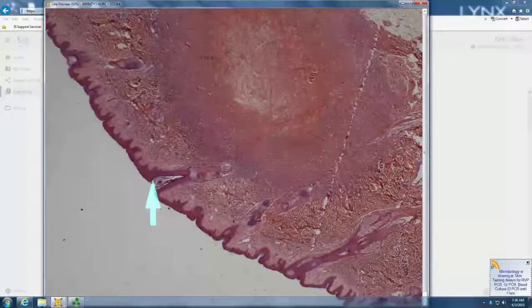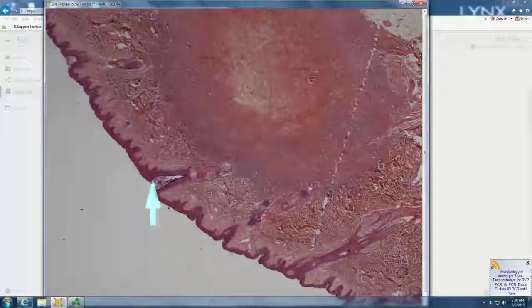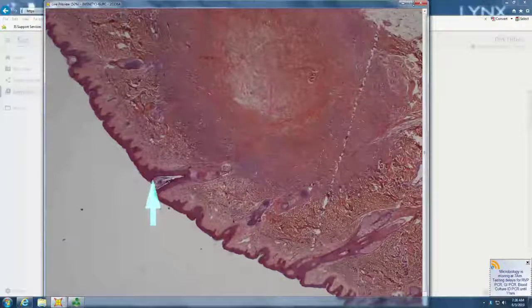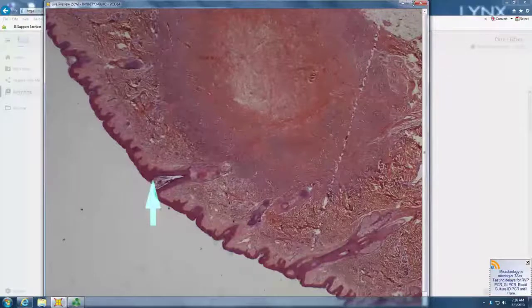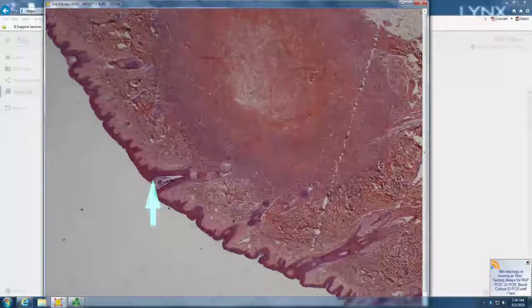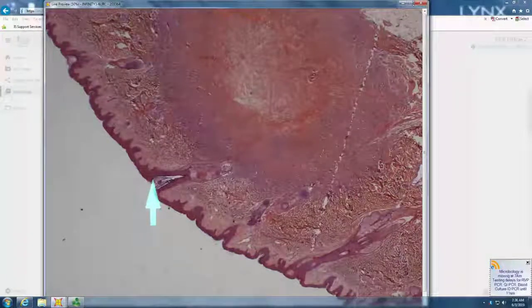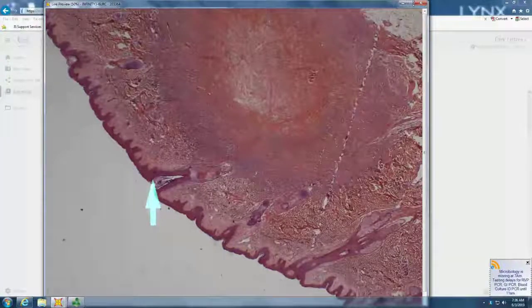It's a good way to start out. When you get into the soft tissue world, there are some characteristic lesions like low-grade Evans tumor, low-grade fibromyxoid sarcomas that have hypocellular areas as characteristic. But to start out with dermal tumors, the characteristic dermal tumor that has hypocellular areas like that is dermatofibroma.